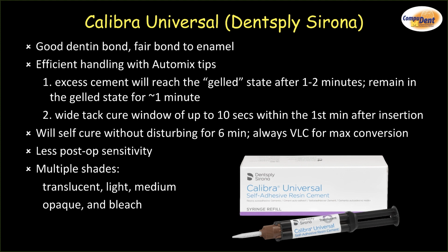You don't have to rush to clean these up, because you've already got them in place. The bond is developing. You don't want to start the moisture contamination, obviously, but they're as easy to clean up as resin modified glass ionomers, unless you're really slow or you've already cured it. Then obviously that's going to complicate things for you.